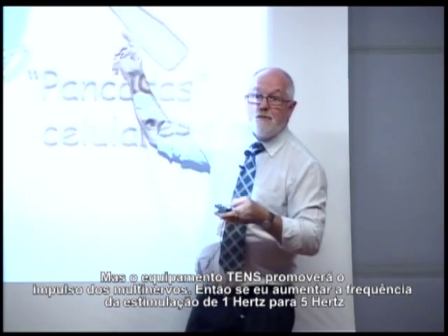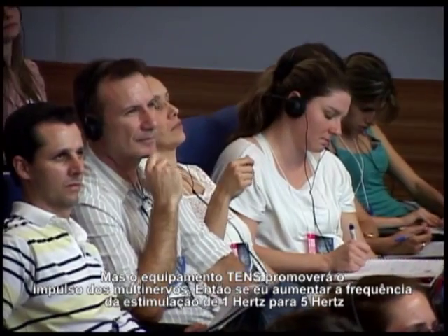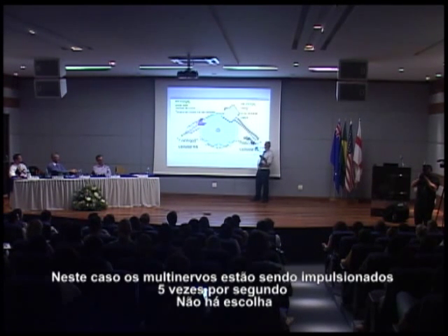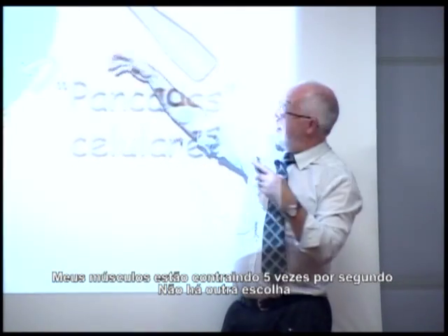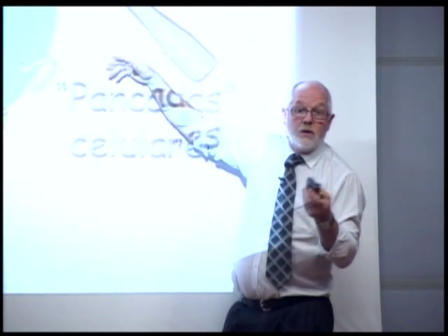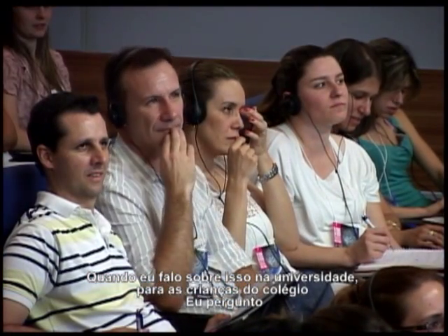So if I increase the frequency of the stimulation, from 1 hertz we'll go to 5 hertz. Okay, so my motor nerve is firing 5 times a second. No choice. My muscle is twitching 5 times a second. No choice. So when I do this talk at the university to school children, all I say next is, shall I keep going? Shall I turn it up?